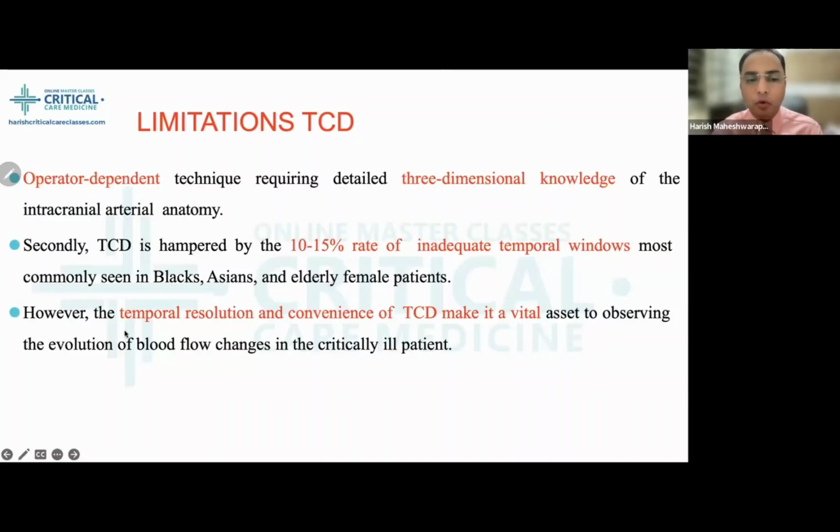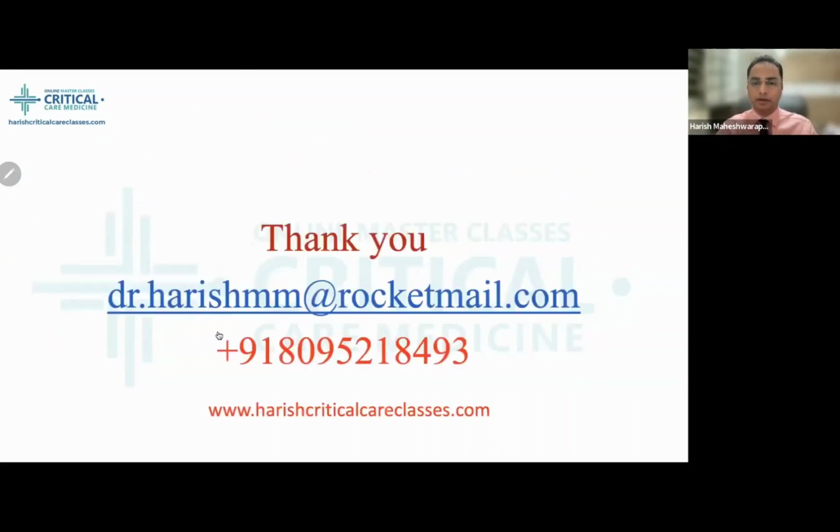However, the temporal resolution and convenience of TCD make it a vital asset for observing the evolution of blood flow changes in critically ill patients. So it has limitations, and it has many clinical applications, but we need some amount of training when we perform the TCD at the bedside.